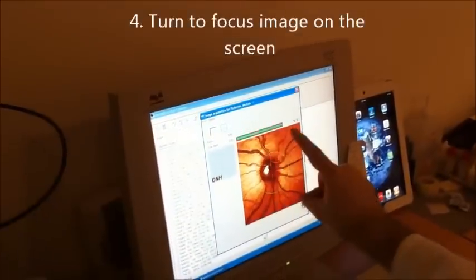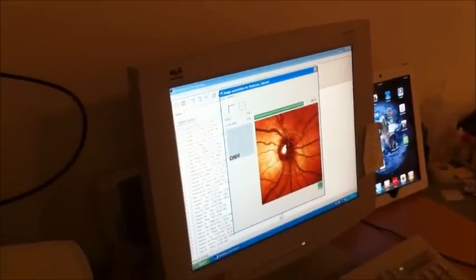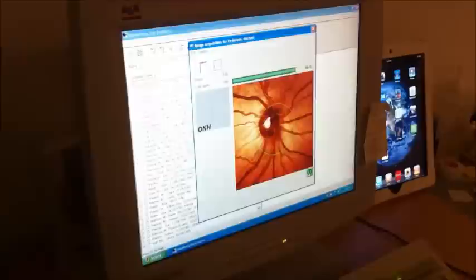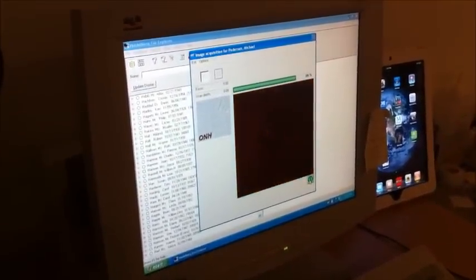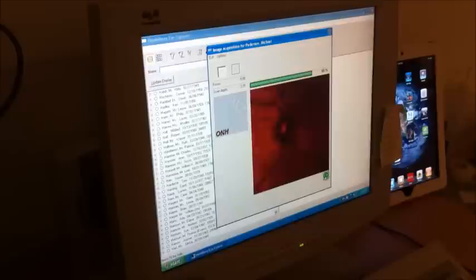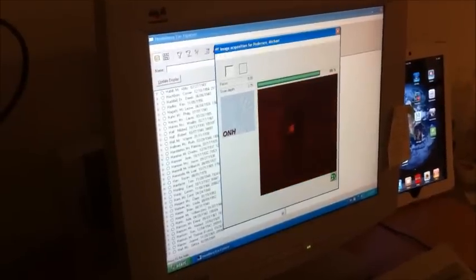We're changing the lens and you'll see the image over here becoming clearer as I dial in the lens. Now you're waiting for a green bar to appear up here — there it is. Just blink again for me. Now we're going to press a little button on the back of the HRT to activate the scan. Blink again for me, then try not to blink or move your eyes for a few seconds. It will take three sweeps. Good, you can blink.